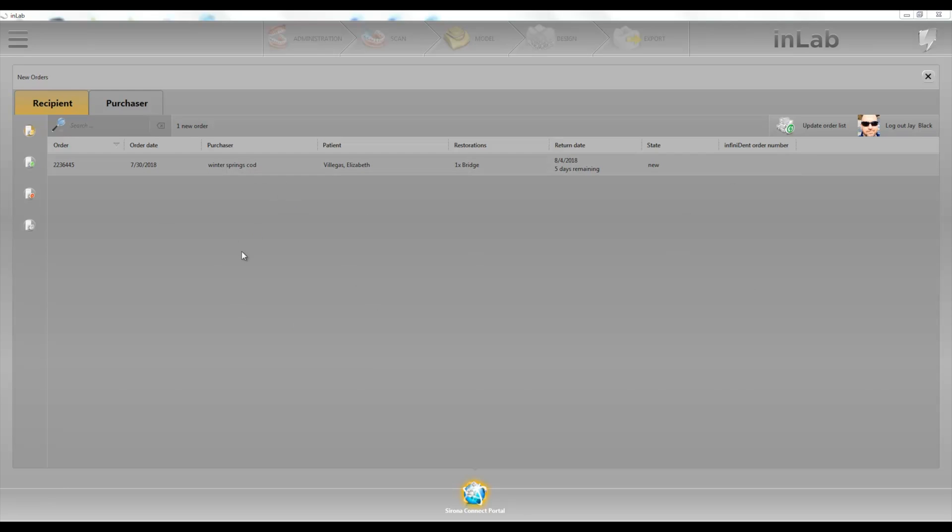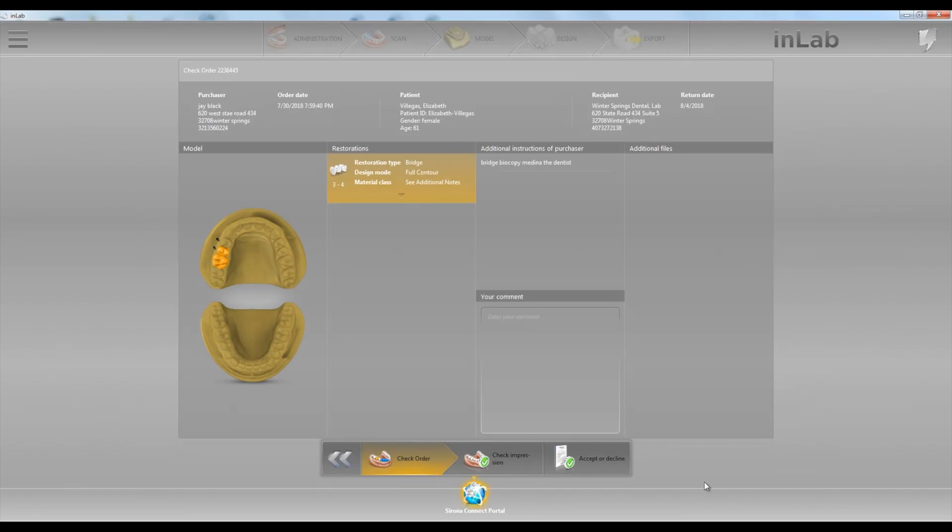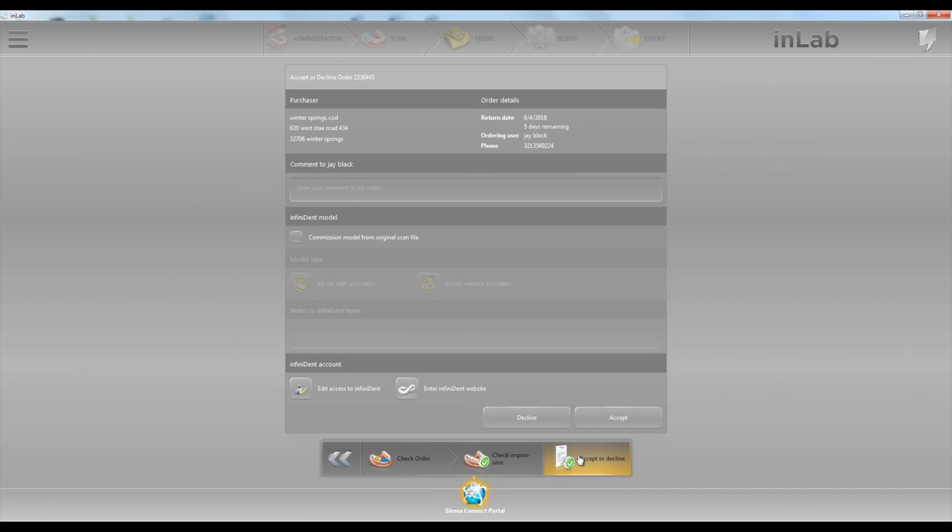So I got this case in and we're going to click on the work ticket, print it out, check the order and go ahead and accept it.